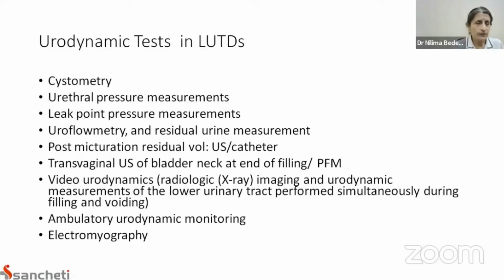We'll go through the different urodynamic tests. When we get the results, we should know what the tests are. So, cystometry, urethral pressure measurement.